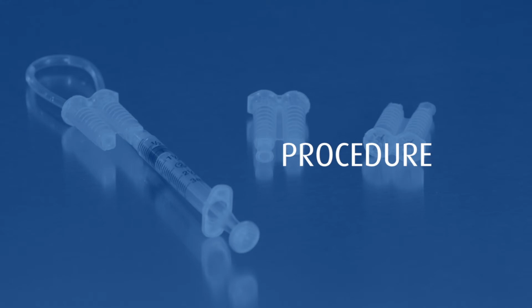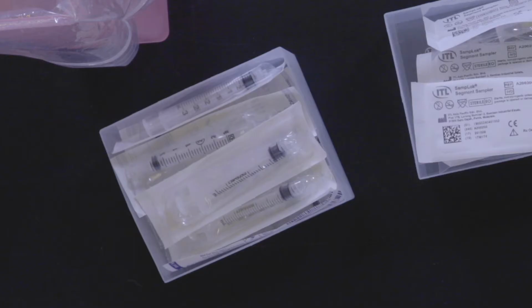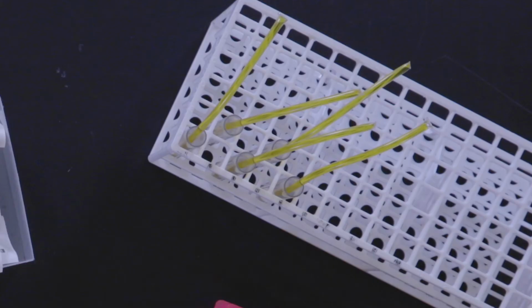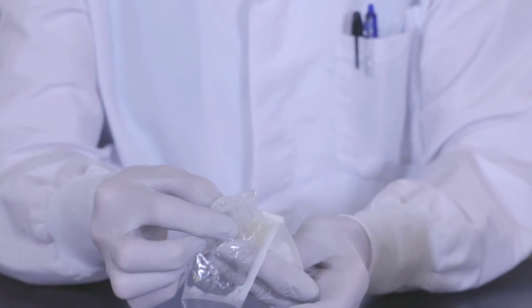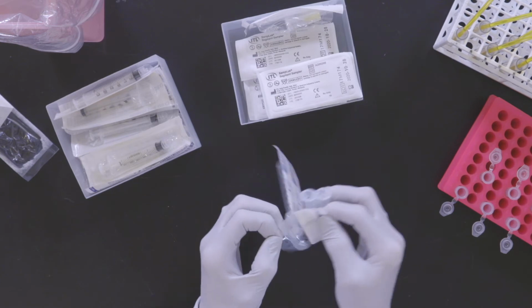Let's review the procedure for using segment sampler. First, gather materials to carry out this procedure, including an appropriate size syringe based on the amount of sample volume to be obtained, a segment sampler, and a tubing segment to be tested. To begin the procedure, open the segment sampler and syringe packages. Avoid touching segment sampler openings, syringe port, and syringe tip.